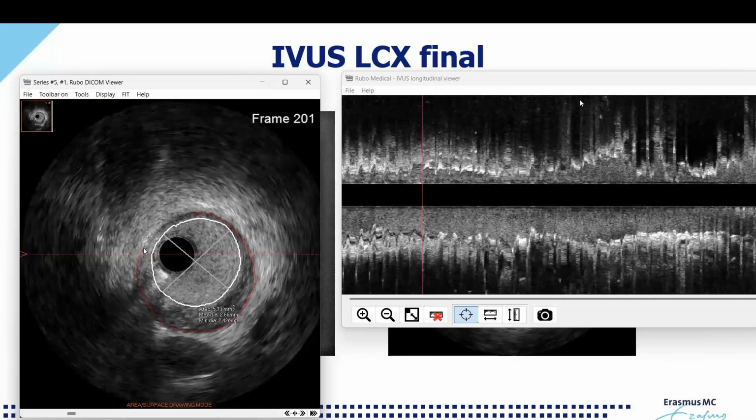If you just use the angio, you will never be able to appreciate whether you cross the proper strut, whether your POT is effective, whether you need kissing balloon, and so on. So I think to me, the IVUS is the ultimate bifurcation stenting tool.